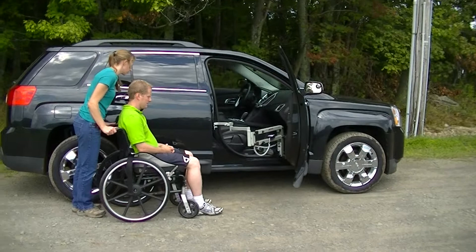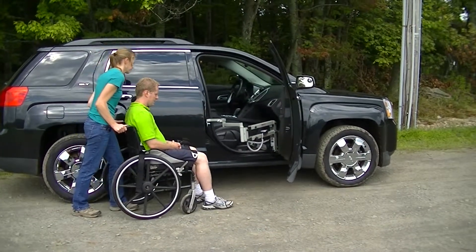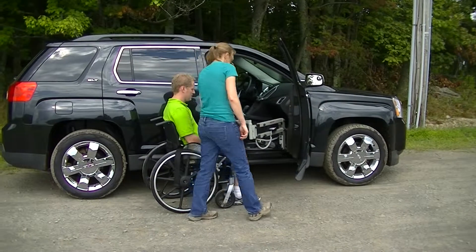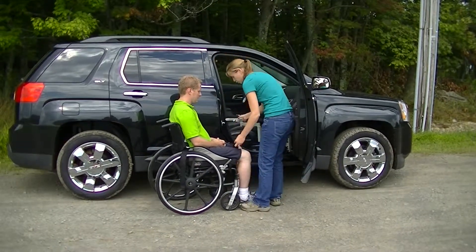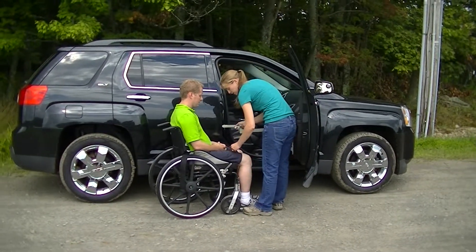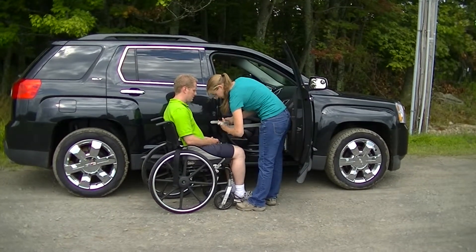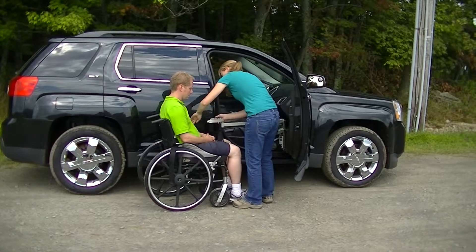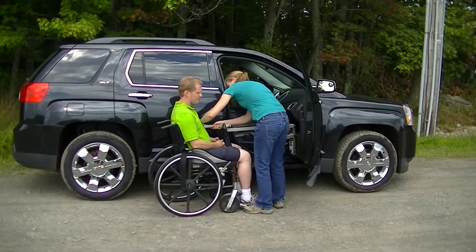I'm going to move the user into place right alongside the vehicle. The back saver sling has been placed ahead of time. For more information on sling placement, visit our YouTube channel at youtube.com/accessun and search sling placement. I'm going to connect the leg tabs first, then the arm tabs.